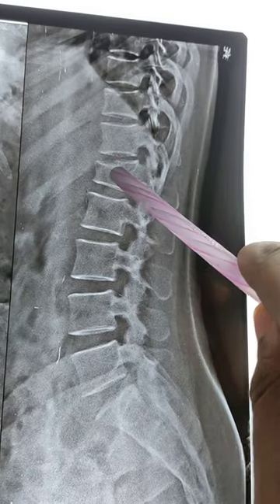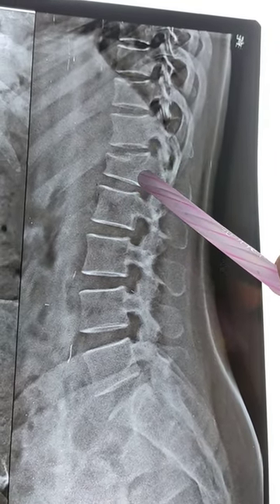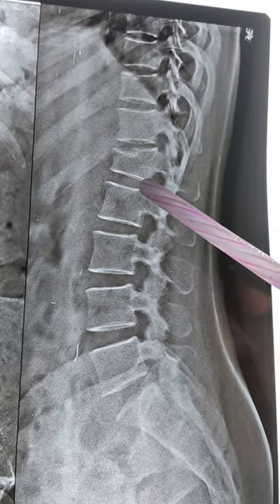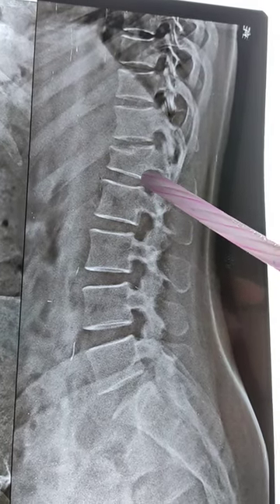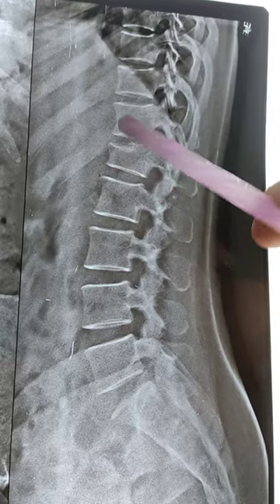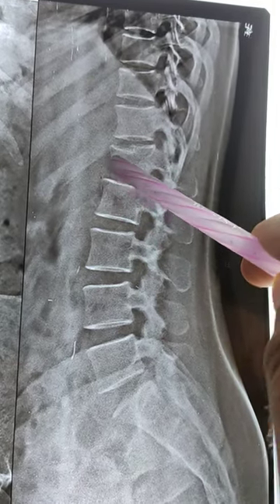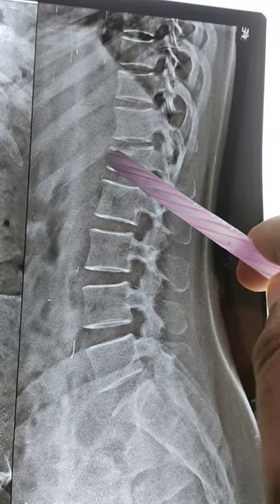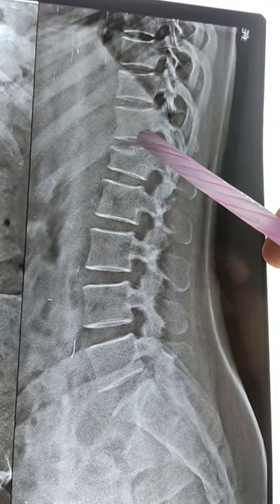There is an anterior wedge compression fracture of the L1 vertebra. So, how do you tell there is a fracture? You should always compare the height of the vertebral body with the vertebra above and below. Here you can see the height of the vertebra is less — collapsed when compared to the other vertebra.